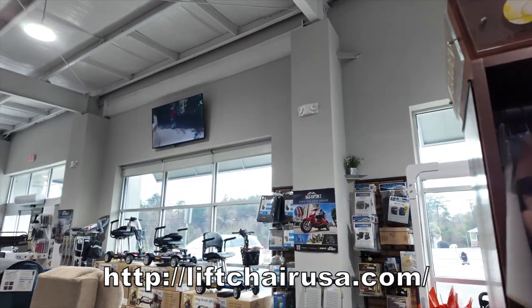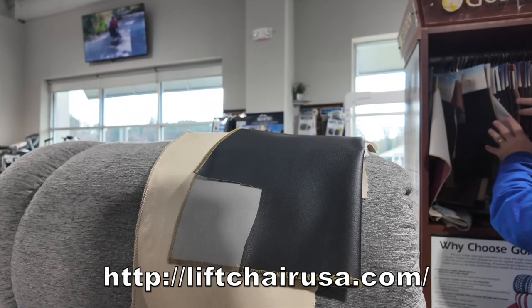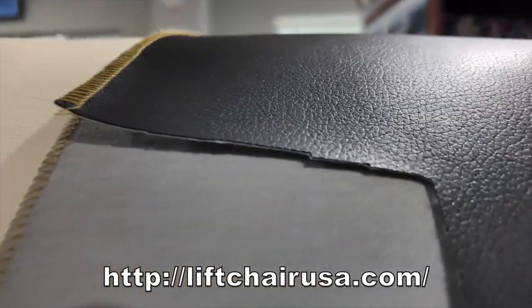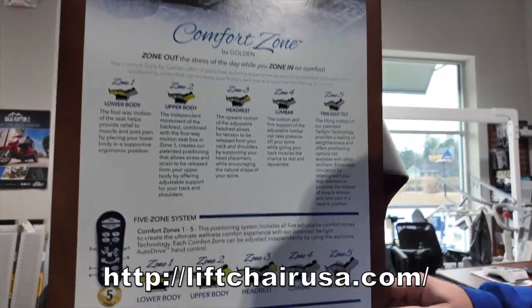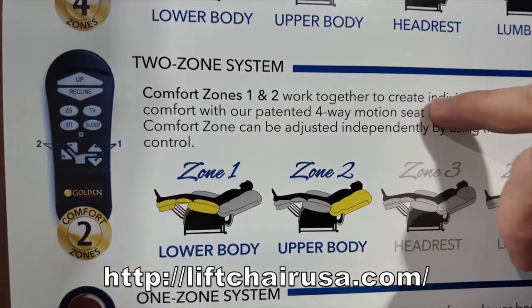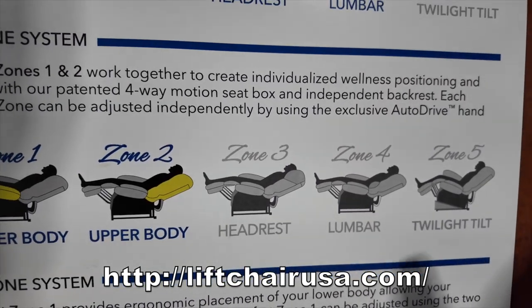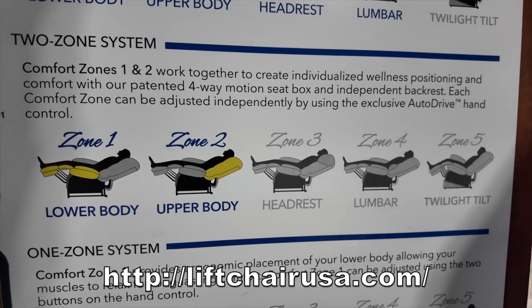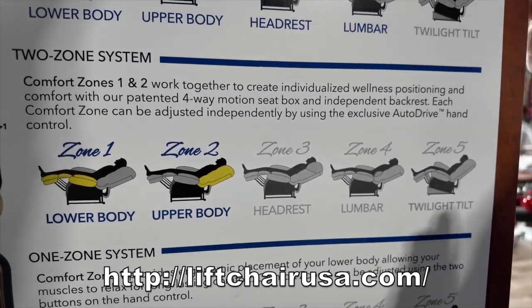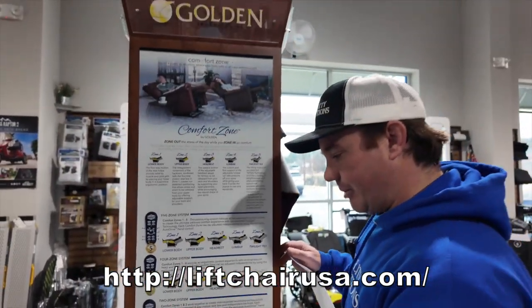Or distressed saddle, black, onyx, Breeza — so there's a lot of different fabrics to choose from. You can see this is in Comfort Zone Two, which has two motors, but it really has more because it has a 500-pound weight capacity. It has three motors on this unit — two that help with the lifting and one that adjusts the back.